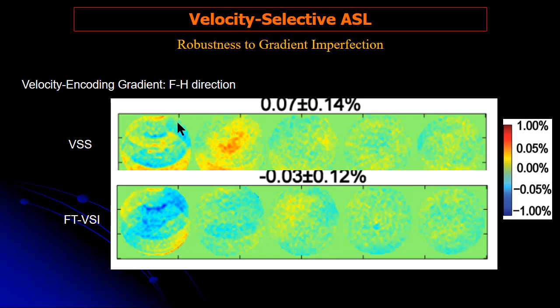For perfusion, we need to be really careful with gradient artifacts, so we optimized our protocol and compared it with the conventional VSS pulse train and showed similar performance.